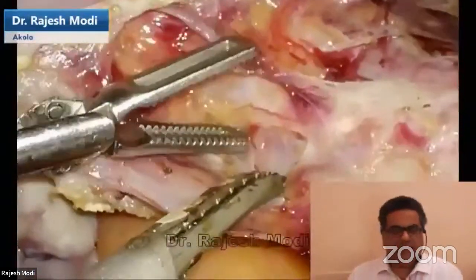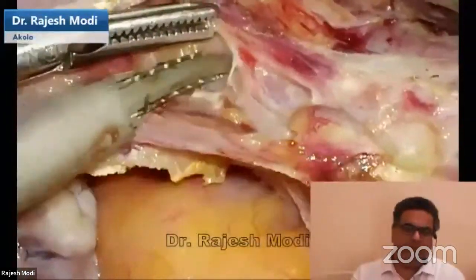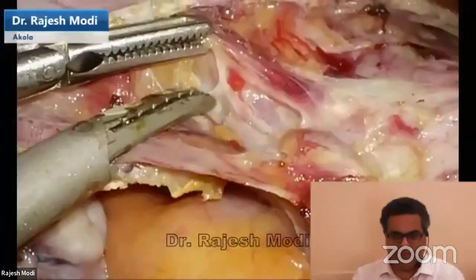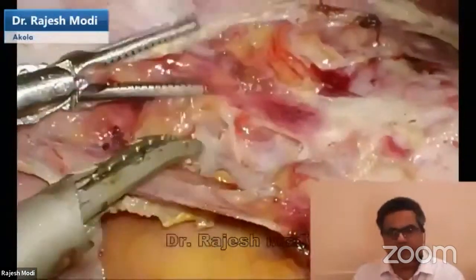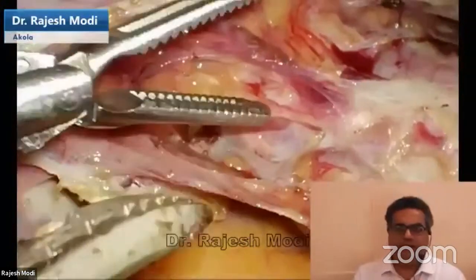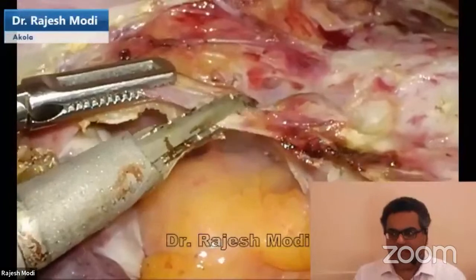Maybe in the initial surgeries, you might have some oozing, bleeding happening when you try to push the pillar down because the pillar is a little bit vascular in some situations, but it is not a hemorrhagic bleed. Let it ooze for 5 ml, 10 ml, it will stop on its own. Never ever be worried and do not overcoagulate in the bladder pillar area.